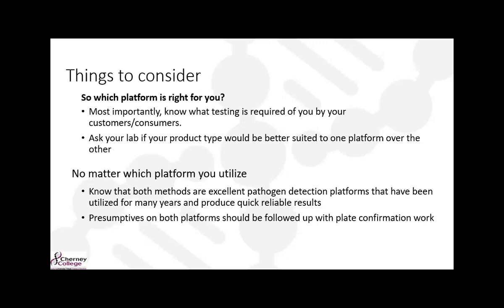But no matter which platform you utilize, know that both methods are excellent pathogen detection platforms that have been utilized for many years and produce quick, reliable results. Also, no matter what platform you're on, product presumptives on both platforms should always be followed up with that plate confirmation work that I stated earlier.